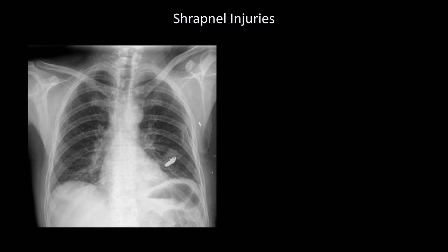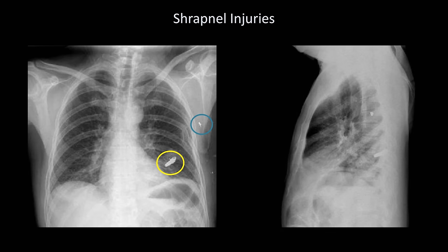Depending upon where you practice medicine, another soft tissue abnormality that may be seen is shrapnel injury. Here is an x-ray of an acutely wounded soldier — there are a number of small metallic objects that have penetrated his body on the left side. One is clearly extra-thoracic, but the largest fragment appears to be within the left lung. However, x-rays are just two-dimensional projections of a three-dimensional body. On the lateral film, the largest fragment is probably posterior to the lungs, sitting between two ribs, with a prominent rib fracture visible on the PA film suggesting the fragment struck and ricocheted.